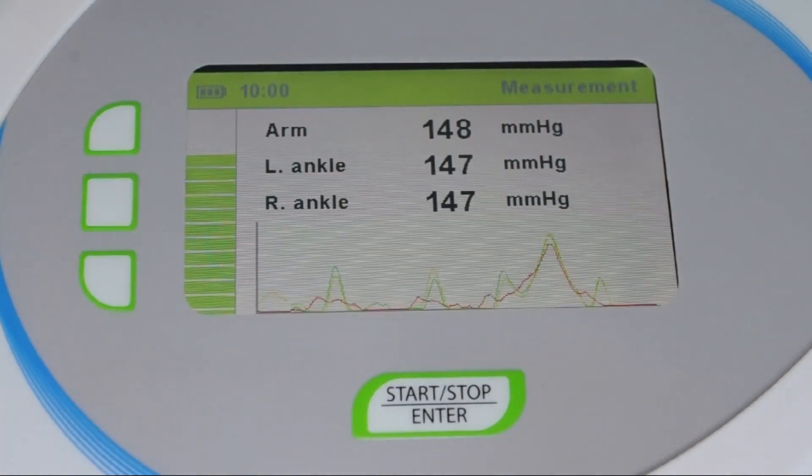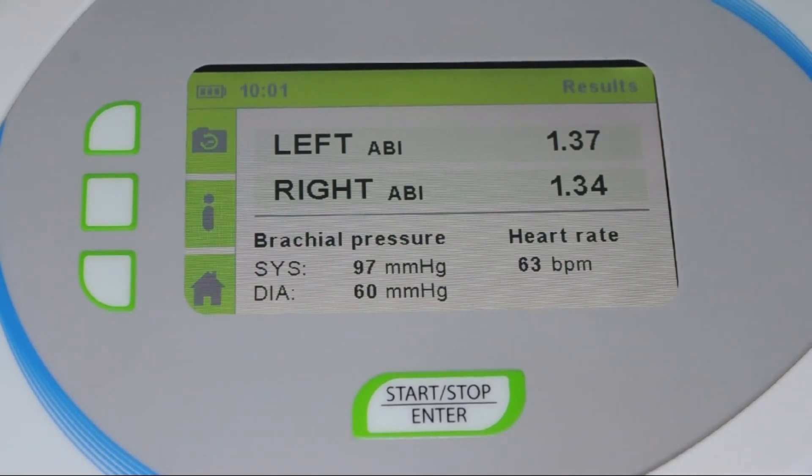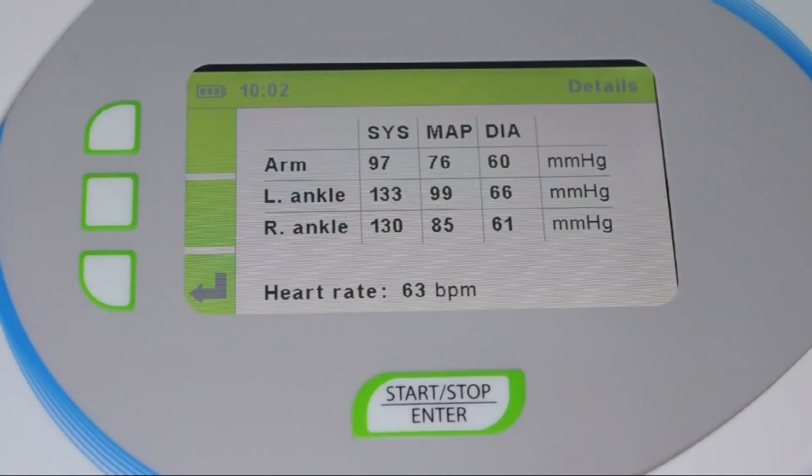The inflation is simultaneous and controlled by an algorithm. After one minute, the ankle brachial index results are displayed in a colored scale that matches the international standard, along with the brachial blood pressure. For detailed information about the measurement, press the I button — a table with systolic, diastolic, and mean arterial pressures for each extremity will show up.